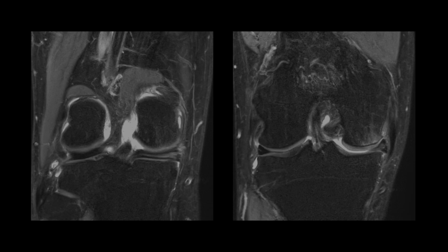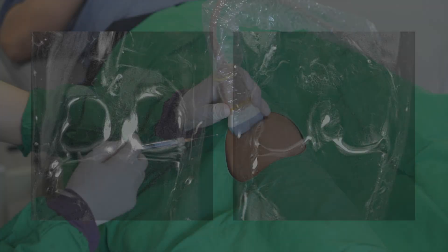In this patient, there is a transverse tear of medial meniscus and degeneration, focal defect of hyaline cartilage of the medial femoral condyle, and subchondral bone marrow edema.